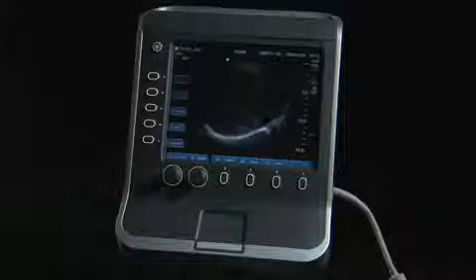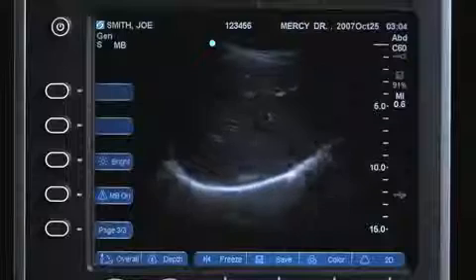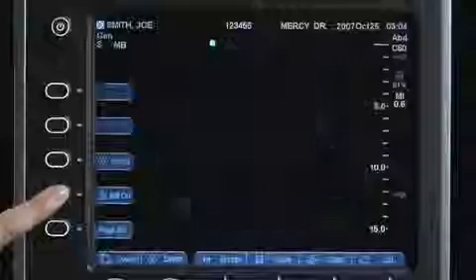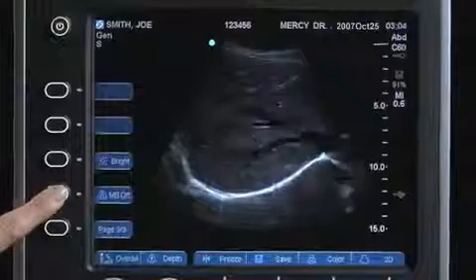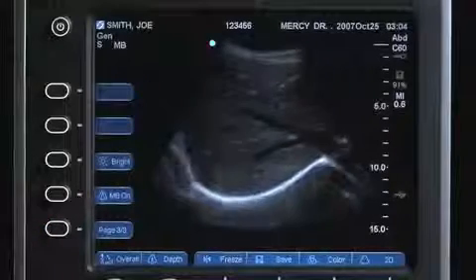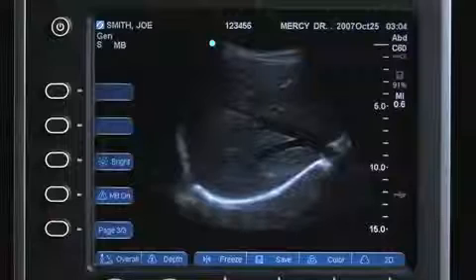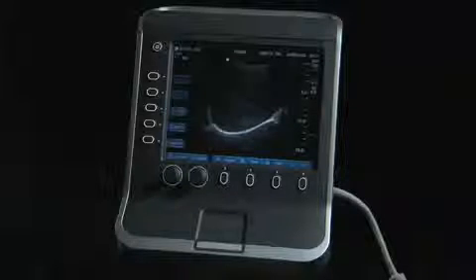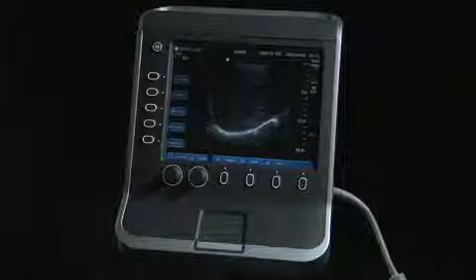SonoMB reduces speckle noise in the ultrasound image, improves contrast resolution, and enhances tissue interfaces and boundaries. This feature can be turned on or off, but SonoSite recommends that SonoMB be used routinely for 2D imaging. To return to the first page of controls, select the 2D imaging key at the far right of the primary controls.